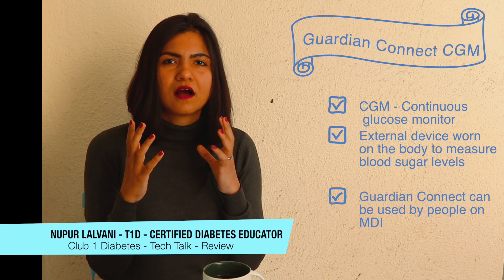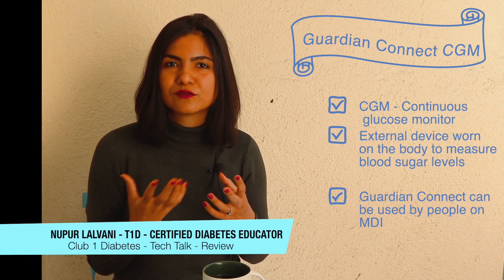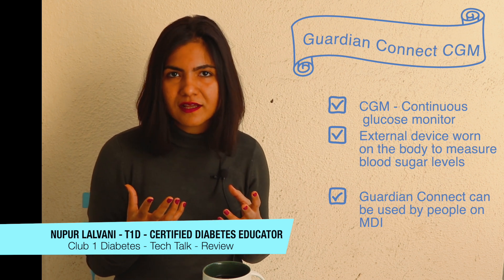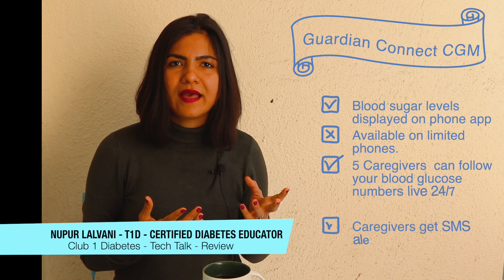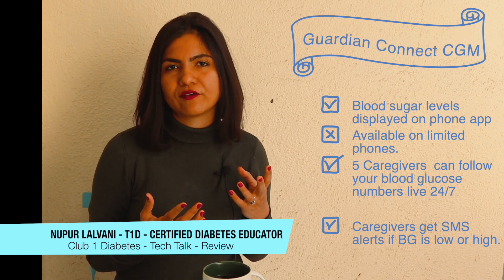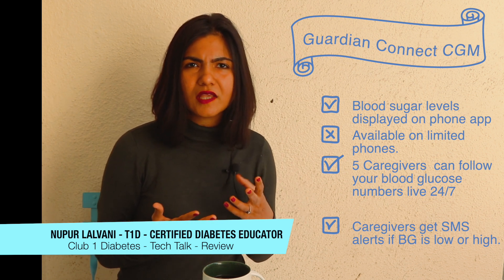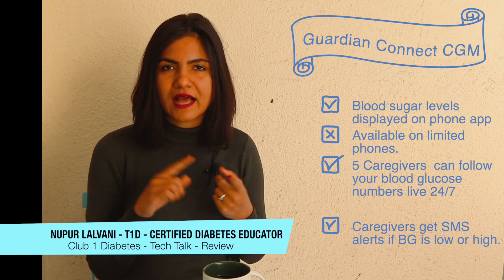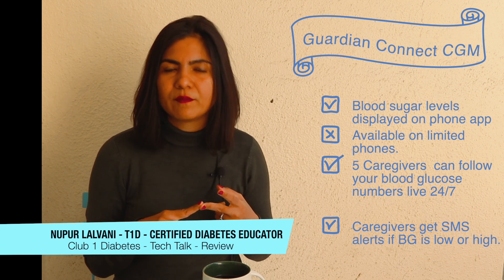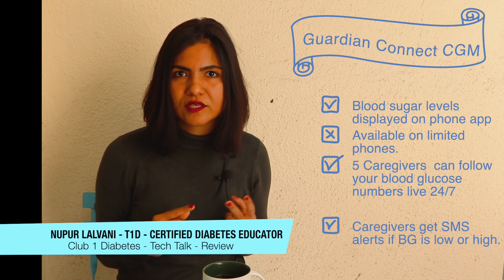Usually CGMs are considered to be something you wear along with an insulin pump. However, the Guardian Connect prides itself on being a standalone CGM, so all you people out there on MDI can also use it very easily. It's linked to a phone app called the Medtronic Guardian Connect, available on the Apple Store and Google Play Store. The tiny drawback here is that this app is available on very limited phones — just iPhones and a couple of Samsung phones are compatible at this point, so that's something you've got to keep in mind.